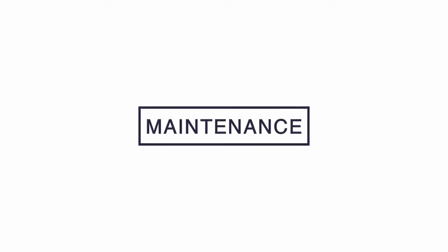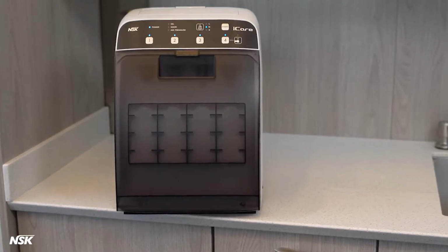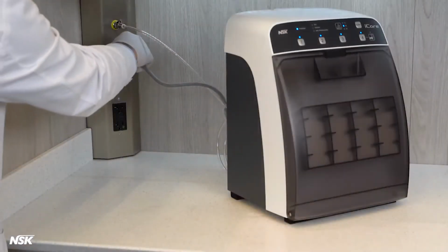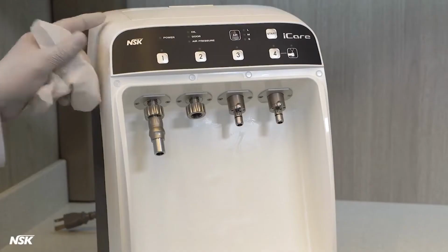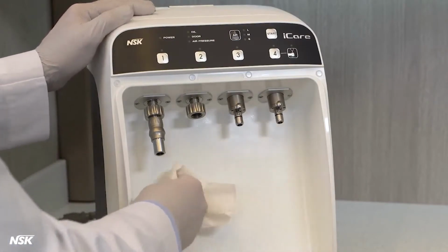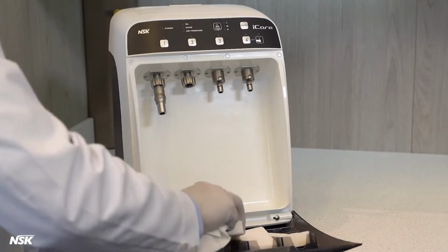Maintenance. To keep your iCare running smoothly, it's important to clean it frequently. We recommend weekly. To clean the main chamber, make sure the power cord is disconnected with the power button off. Then, simply clean inside the chamber using a paper towel and alcohol. Replace dirty and used sponges and absorbent sheets when they get dirty with debris.